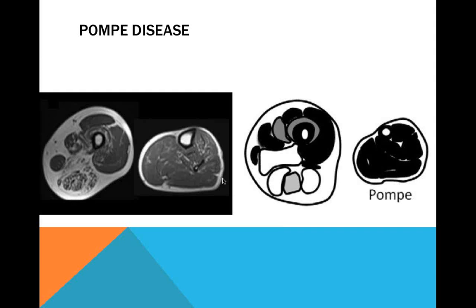And if you do an EMG on them, you can see myotonic discharges, which are basically kind of dive bomber sounding electrical discharges that are elicited by the muscle when you stick a needle inside there, which are characteristic for both Pompe, some of the other myotonia conditions, and also myotonic dystrophy. Myotonia conditions being like paramyotonia congenita, myotonia congenita. And basically here you can see that it's more posterior than anterior involvement of the muscle, and it's more proximal in the thigh than it is distal.